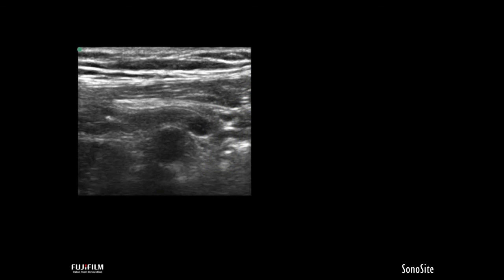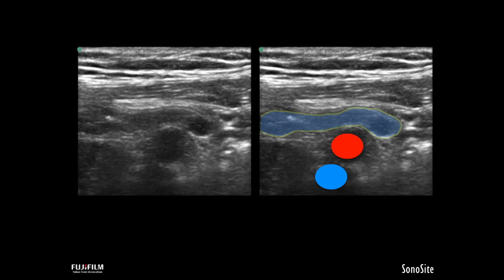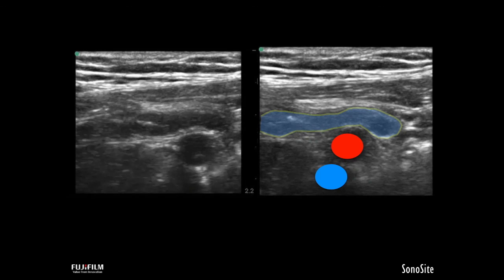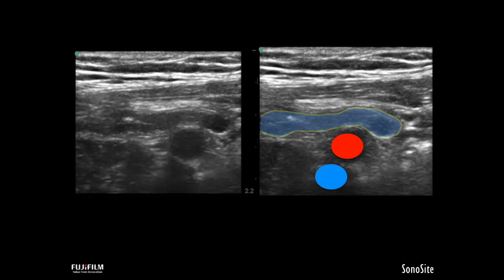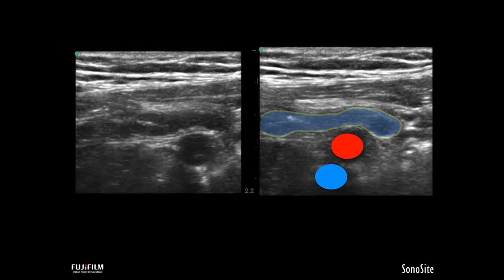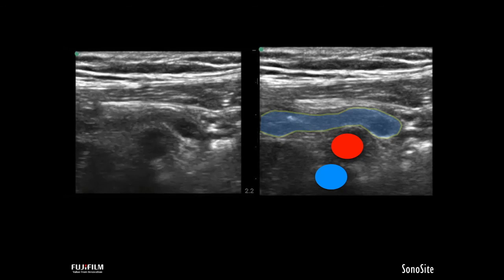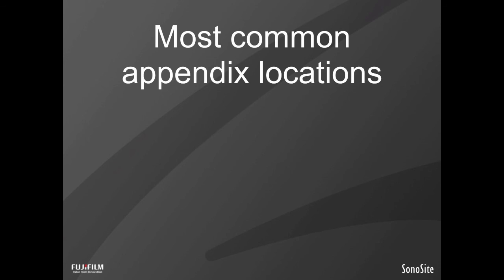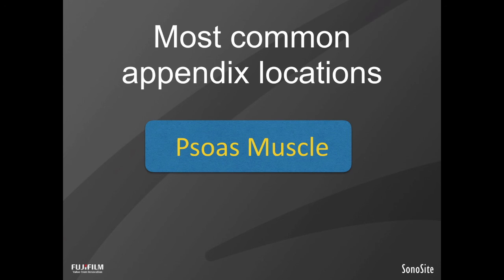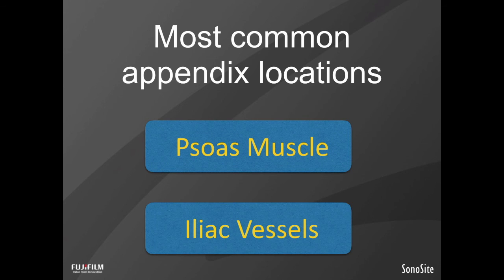Here is a visualization of a normal appendix. We have identified the iliac vessels, and you can see the appendix — it's sort of like a snake that just drapes over, or like the balloons used to create balloon animals. The two most common locations where we can identify both a normal and abnormal appendix are in the area of the psoas muscle — around or just over the psoas muscle, just below or just above the iliac vessels. We use these two locations as our main points of identification.